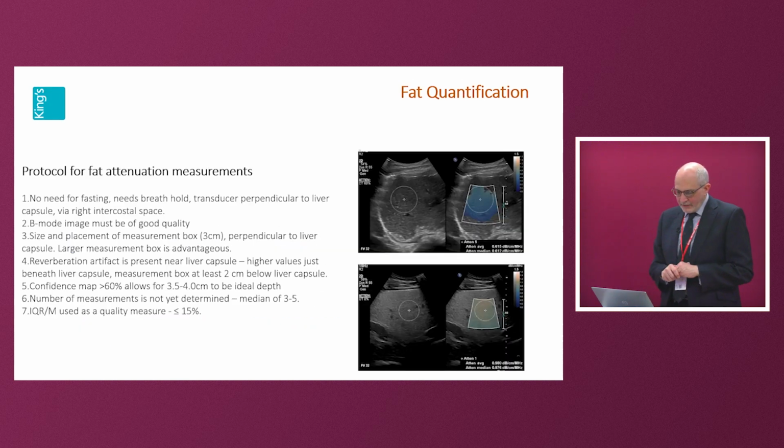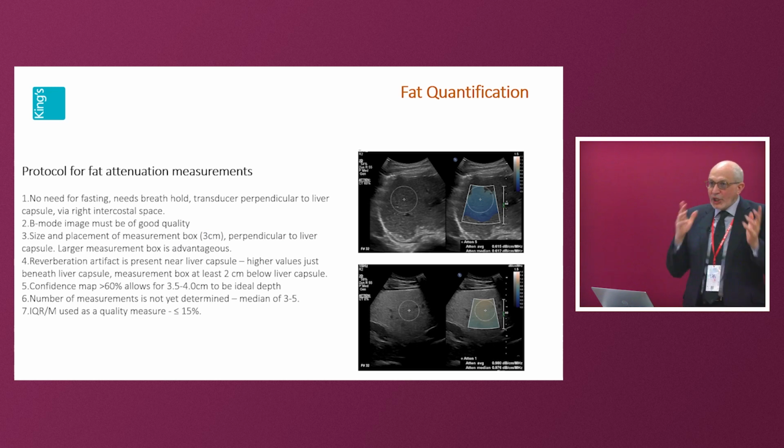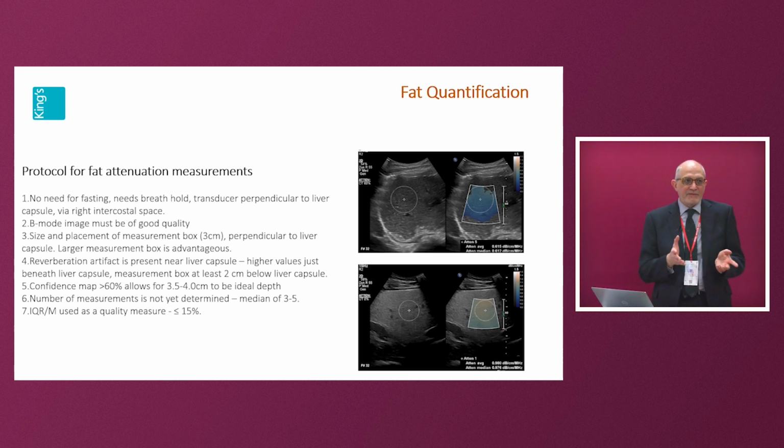So what is the protocol for fat attenuation measurements? I know this is coming through because I've got the paper on my desk as editor of Ultrasound in Medicine and Biology, and it's accepted for publication, and it's the guidelines from WFUMB. So these are coming through. And this is what they recommend when you're measuring fat attenuation. You don't need to fast, but if you're going to combine it with your fibrosis measurements, you're going to fast because you need to fast for fibrosis. So you might as well do both together.